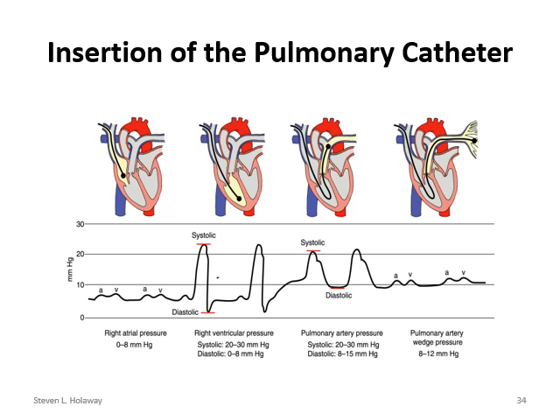This is the right ventricular waveform. These are pulmonary artery waveforms. So the balloon is up still, so we're watching these, watching it go through, and then once that balloon actually wedges, we'll see the change in the waveforms here. Once it's wedged, they will lock it down, and then they'll deflate the balloon, and then what you should see once they deflate the balloon is a waveform like this again. So you know then you are in the right place.